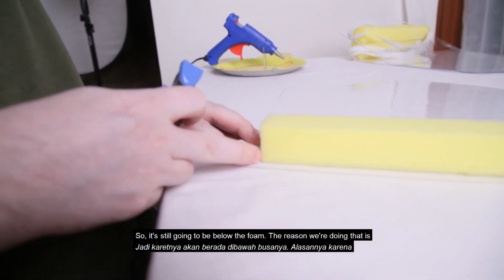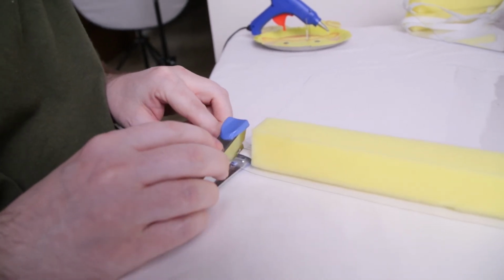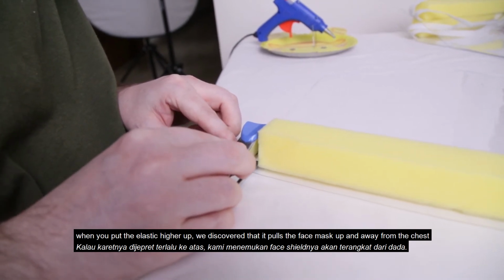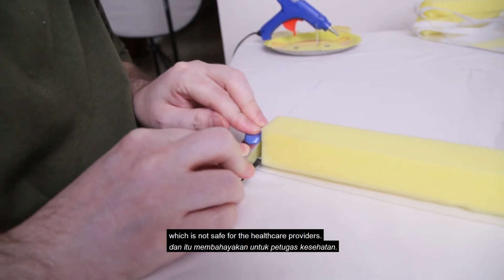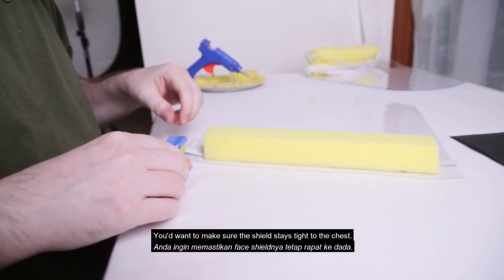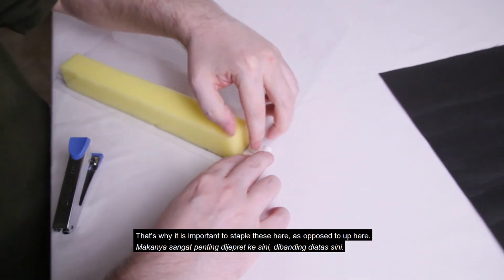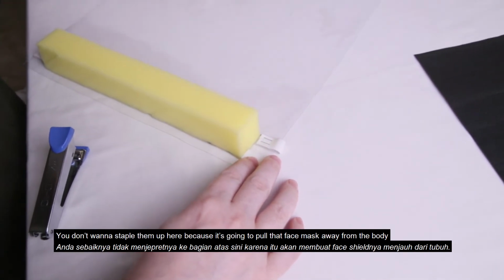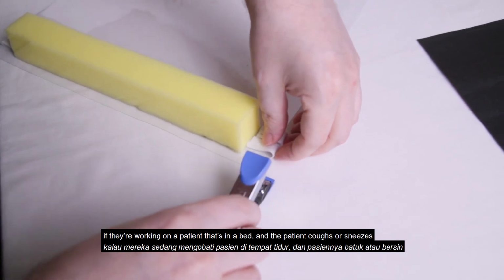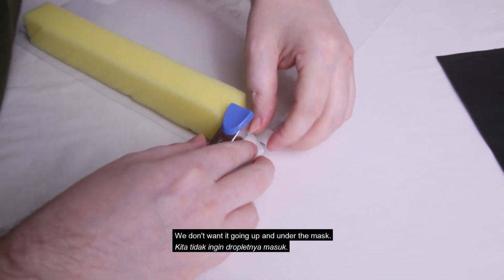Okay. So it's still going to be below the foam. The reason we're doing that is when you put the elastic higher up, we discovered that it pulls the face mask up and away from the chest, which is not safe for the healthcare providers. We want to make sure the shield stays tight to the chest. And that's why it's important to staple these here as opposed to up here. You don't want to staple them up here because it's going to pull that face mask away from the body. And if they're working on a patient that's in a bed and that patient coughs or sneezes, we don't want it going up and under the mask.